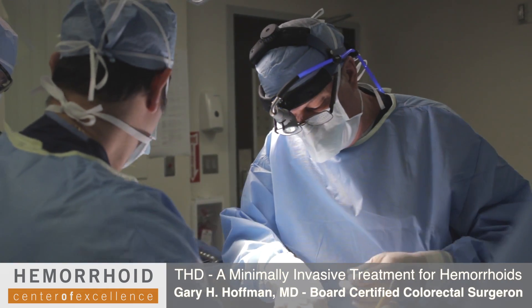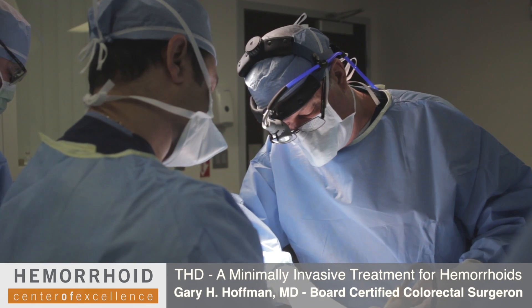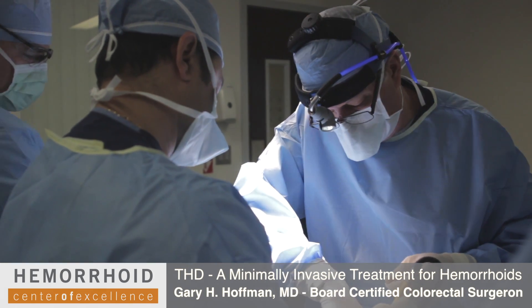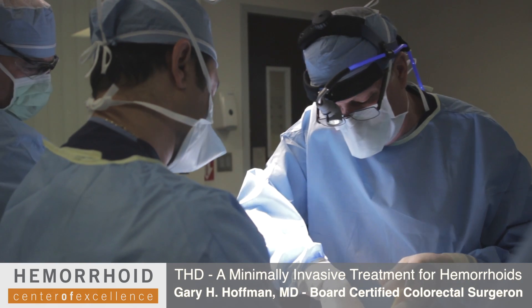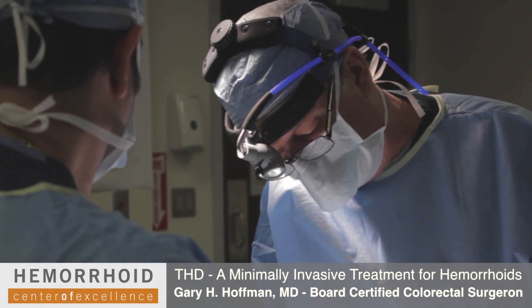The next step will be to do what we call the PEXI portion of the procedure, whereby we lift the hemorrhoid up and put it back to where it began so that the patients no longer experience prolapse or a falling out of the hemorrhoid. In order to do that, I'm going to remove the roof or the channel.